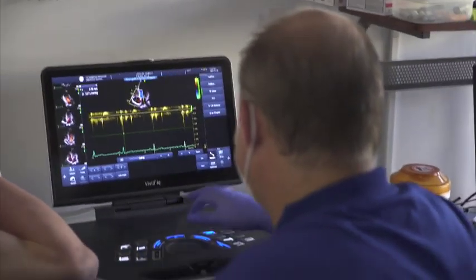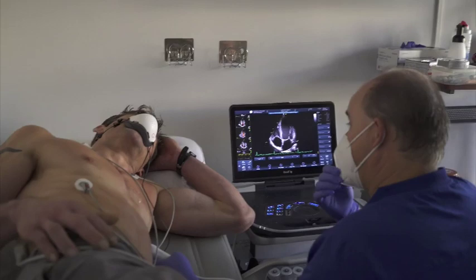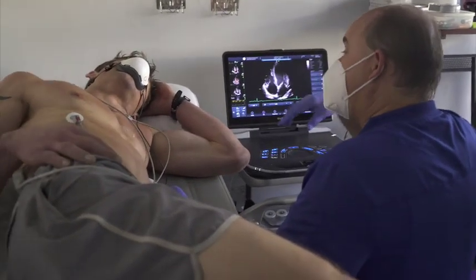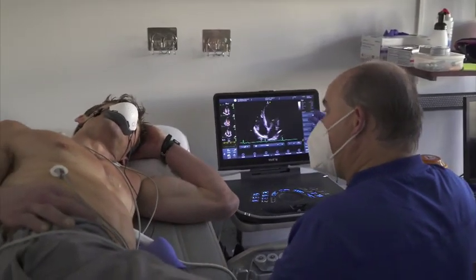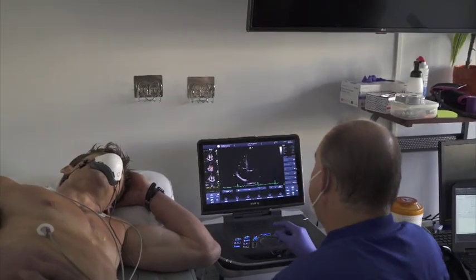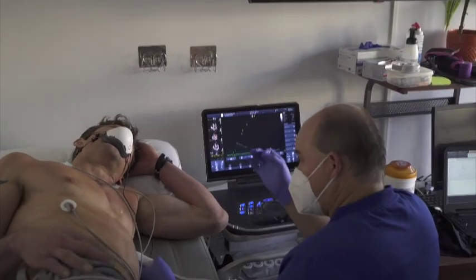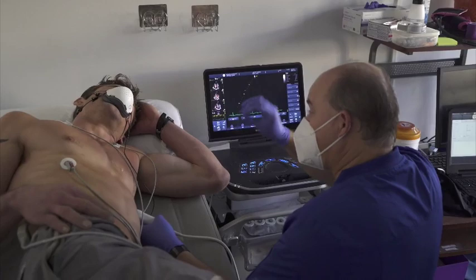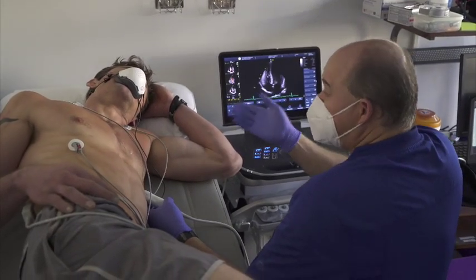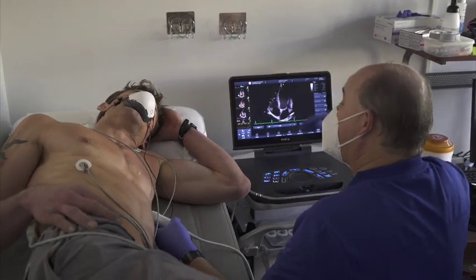As you go through the ultrasound, you're identifying different areas, taking images, and listening. We follow a specific protocol — a series of images covering each chamber and valve, using color flow to watch blood flow, and Doppler to take actual measurements of velocity through the valve. We check the valve for two things: function — making sure it's opening and closing, not prolapsing, not stenotic from heavy calcification — and whether there's any leaking from calcium deposits. Routinely we do echocardiograms to monitor chamber sizes, valve regurgitations, and the progression of those abnormalities.